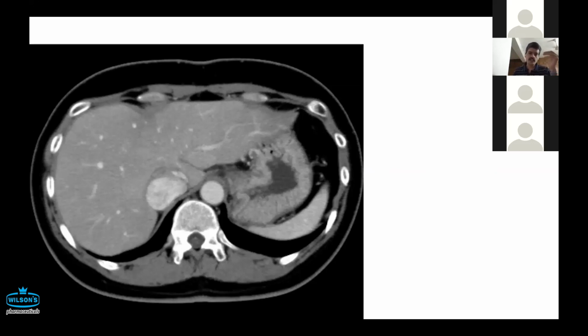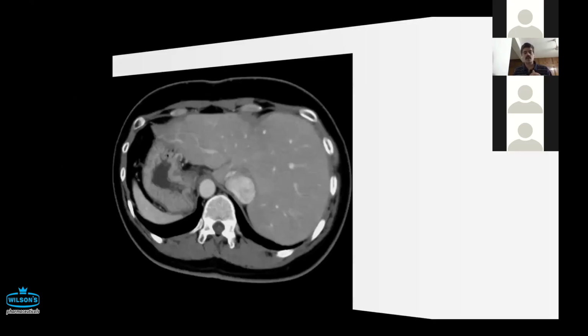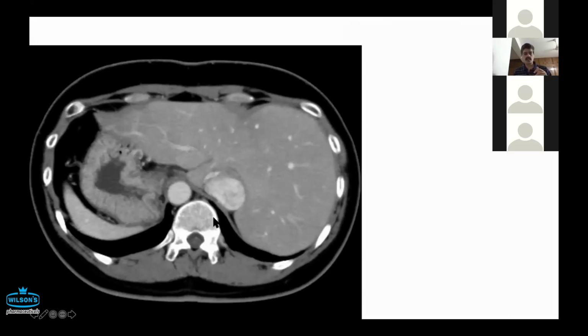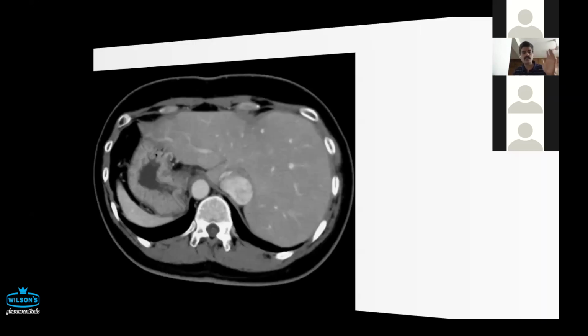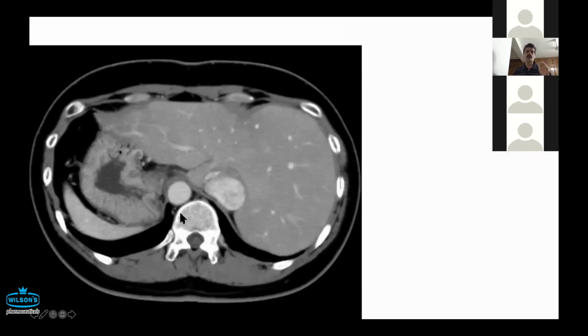But the CT scan, as you know, is oriented as if you are looking into the human body from below above. This orientation does not work in EUS. What we would like to imagine the EUS is like this. So let me take you back. This is a CT scan, but on EUS, we imagine structures like this. Now we are looking into the human body like the textbook of a Gray's Anatomy from above down.